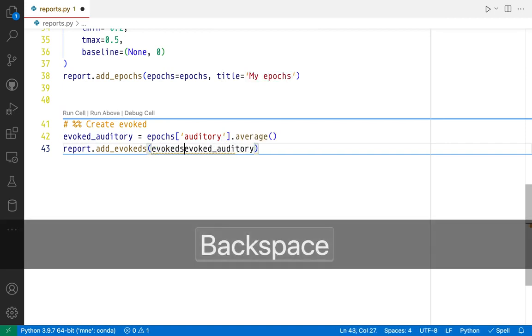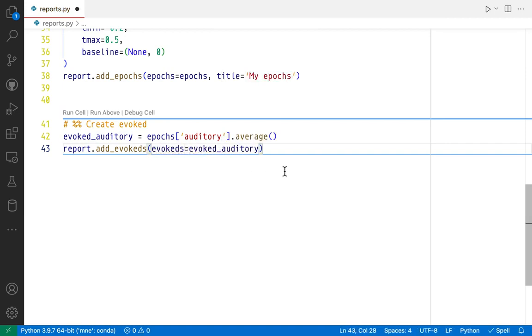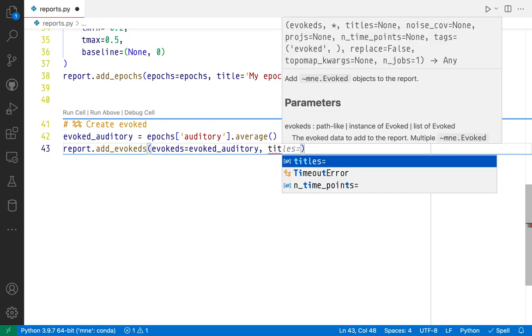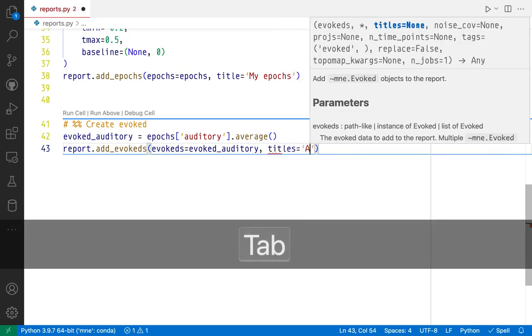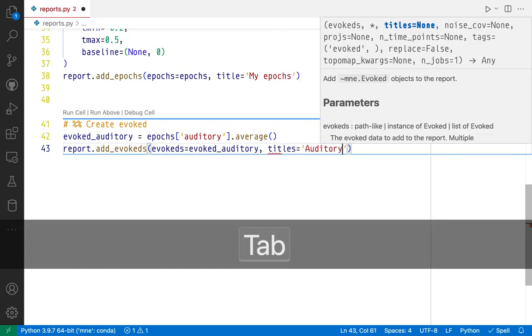Evoked equals evoked_auditory. The title is going to be auditory.